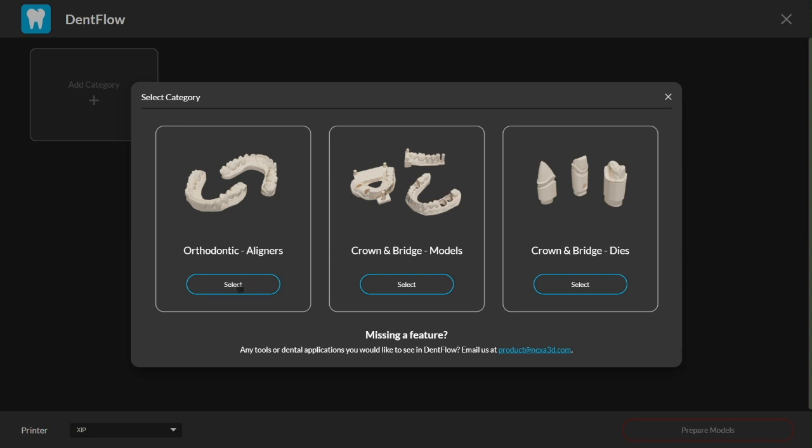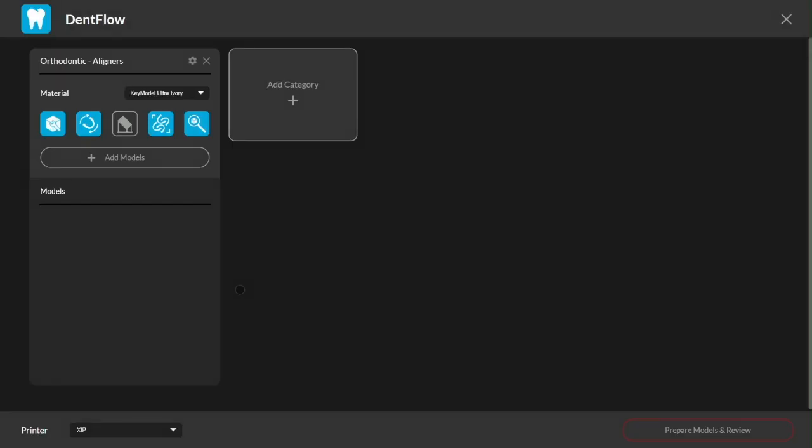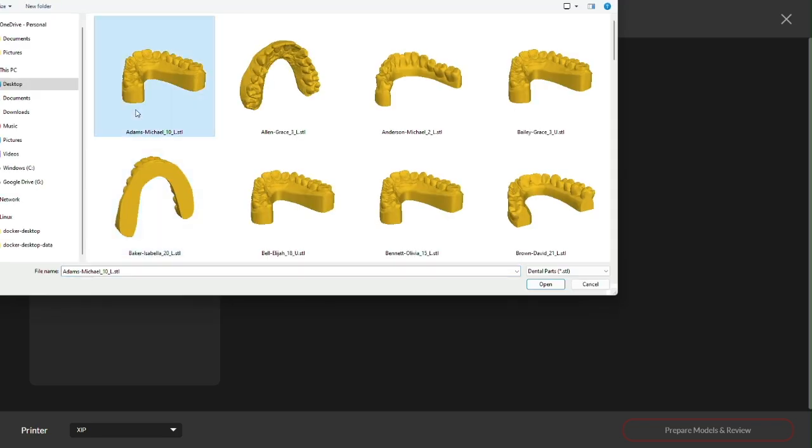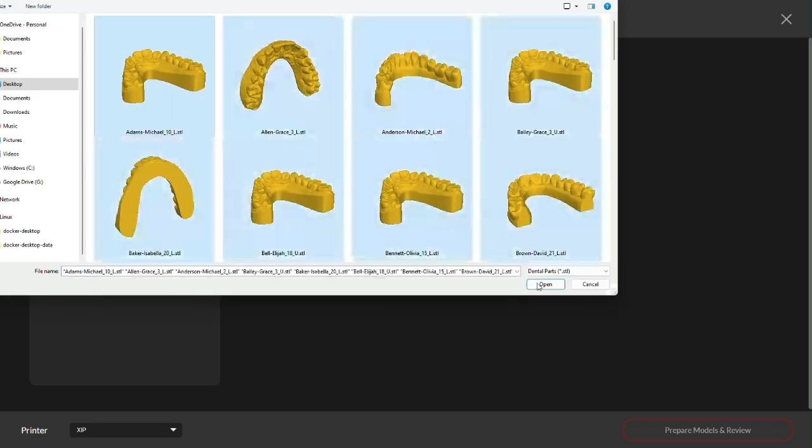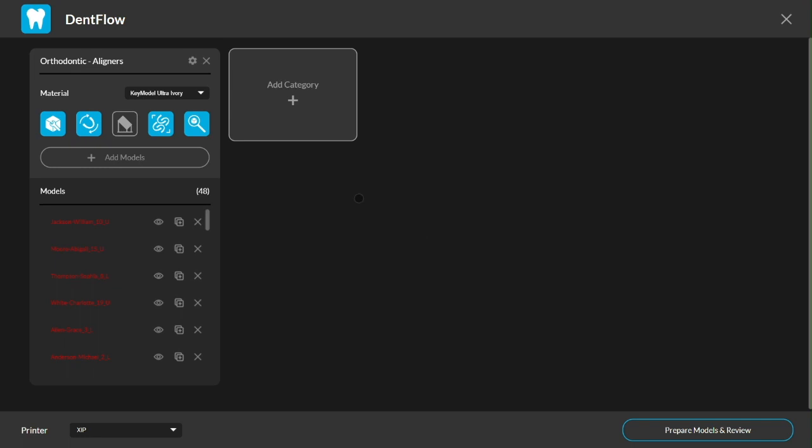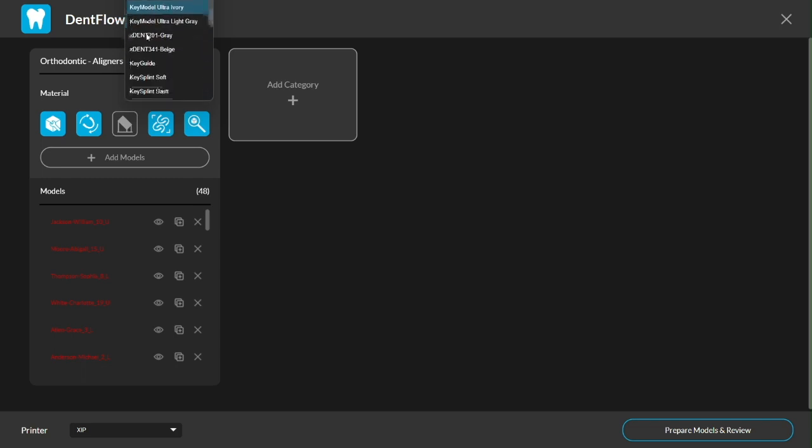Now I'm going to start by adding all the aligner models I need to get printed today. I think there's about 48 in total which is kind of a lot. Then I'll select a material from the vast portfolio of validated resins. Let's try the new Extent 341 beige.